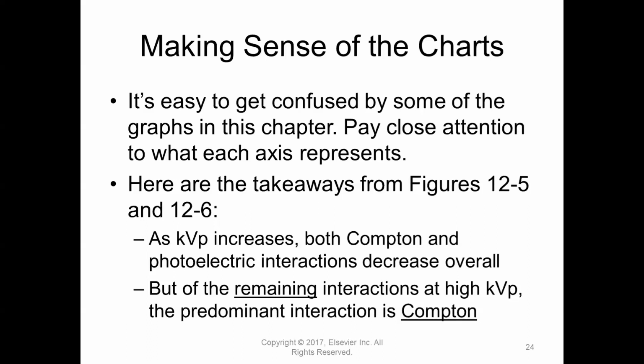So that's number one. Number two, as you increase your kVp, the interactions that are left over at high kVp are predominantly Compton. We'll get into that a little bit more as we start looking at these illustrations.